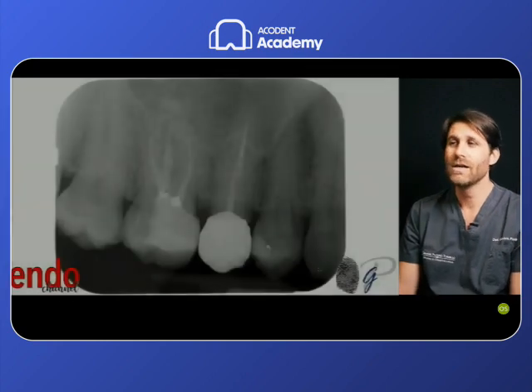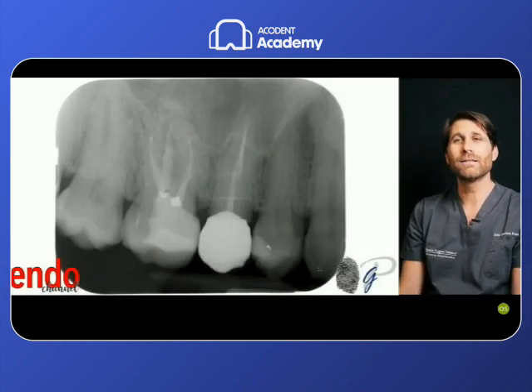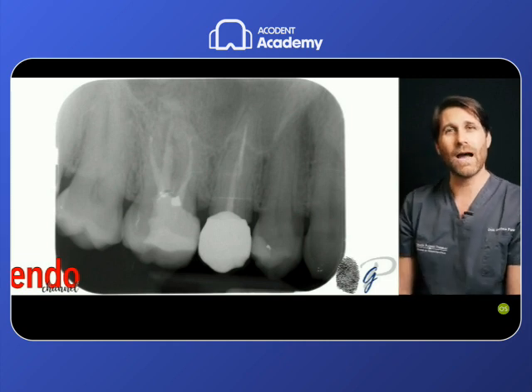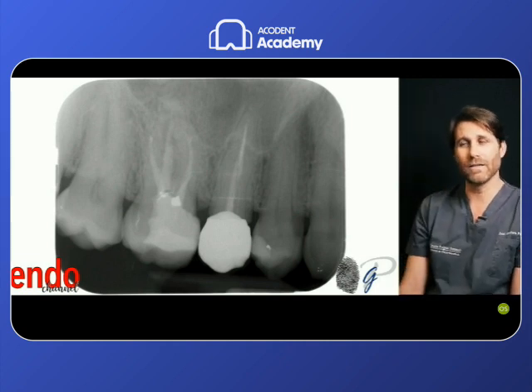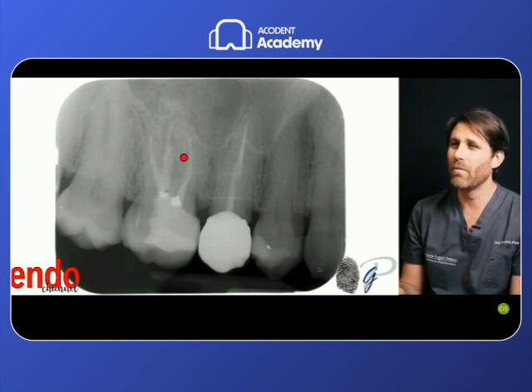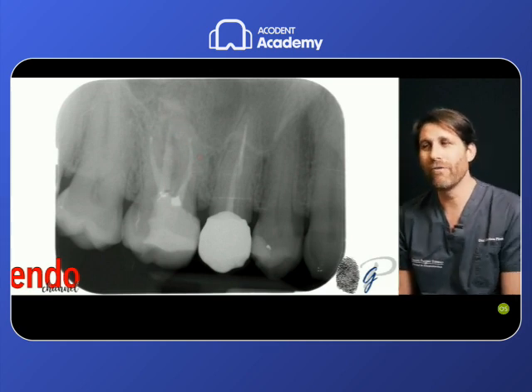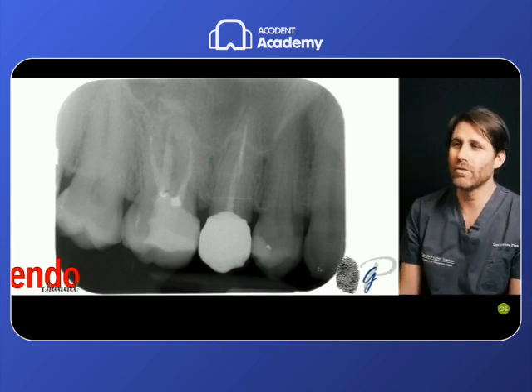Let's have a look at different clinical cases in which you can apply these properties for a direct mechanical scouting with a mechanical reciprocating file. This is a retreatment of a first upper molar in which obviously we have a lesion of the mesial root, and we obviously will find a missed MB2 root canal. We know it even without a CBCT.